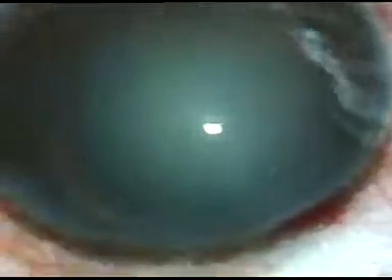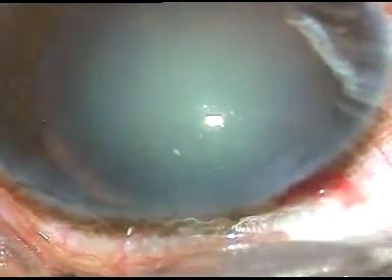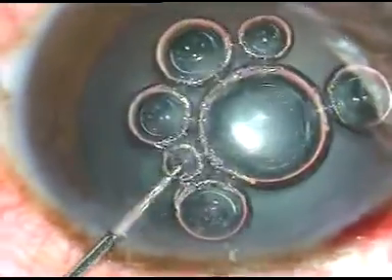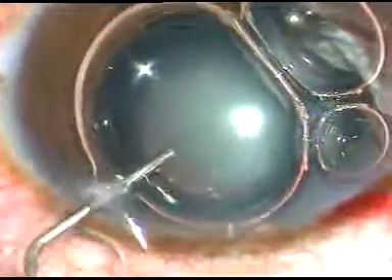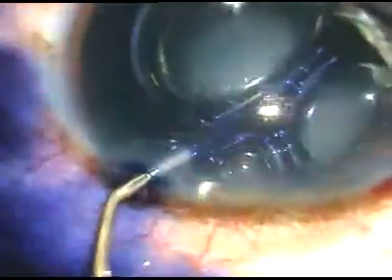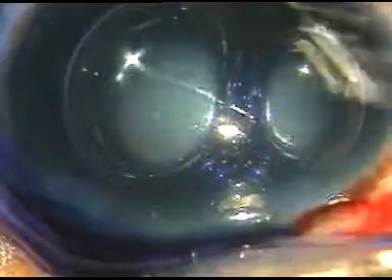I want to stain the anterior capsule of the cataractous lens with trypan blue dye. I have taken a 1 cc narrow bore syringe with air in front — here is the air and then comes the dye, 0.06% trypan blue dye. The anterior capsule is stained and after a few seconds the dye is washed out.